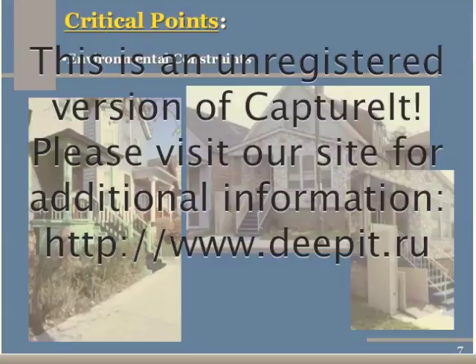So think about it for a second. If the first floor porch is 5 feet from the ground, like in the photos on the left, how long will that ramp need to be? That's right, long enough to end up across the street. Hence, the quick installation of a ramp is not so easy anymore. The photo and its inset on the right are of a home with a vertical platform lift. This allows the individual to start out at ground level and travel vertically to the first floor level. Of course, space, cosmetics, and safety are always considered.